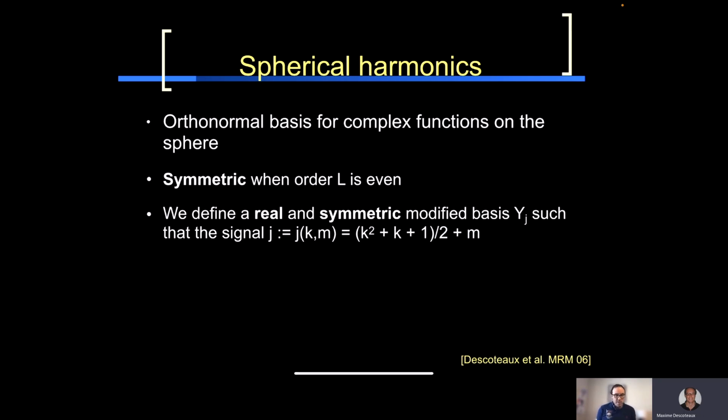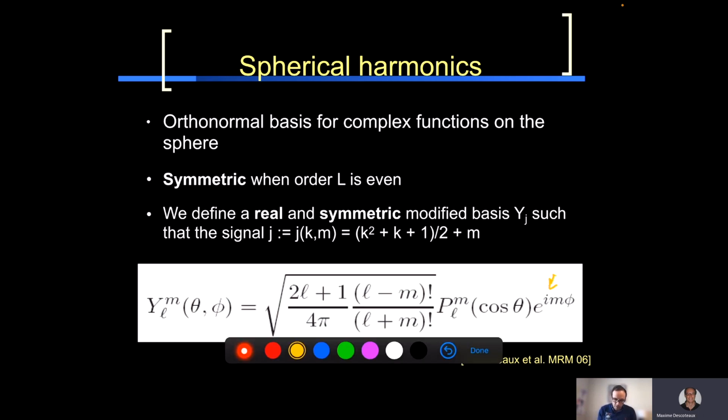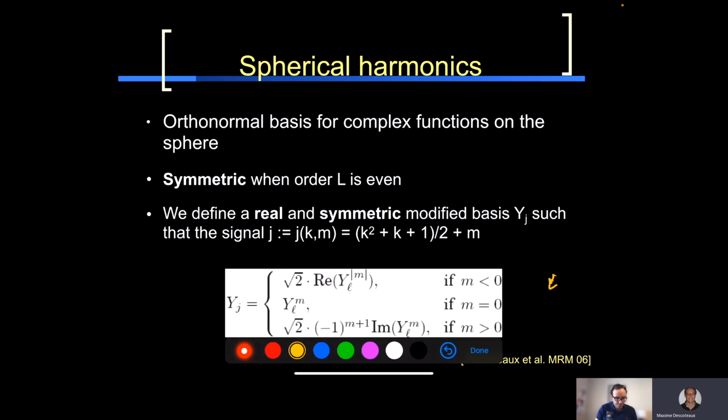Well, spherical harmonics is the same idea. You can reconstruct any spherical function on the sphere just with a series of spherical harmonics coefficients. It's just a bit more complicated than the x, y, z vectors, because in theory you have an infinite number of spherical harmonics, a bit like the Fourier transform. So we're going to have to truncate our basis at a specific order. It has a mathematical formulation. You see a complex number here. It looks like a sine and cosine on the sphere with a normalization factor. Let's not focus on the math. You can read that on your own.